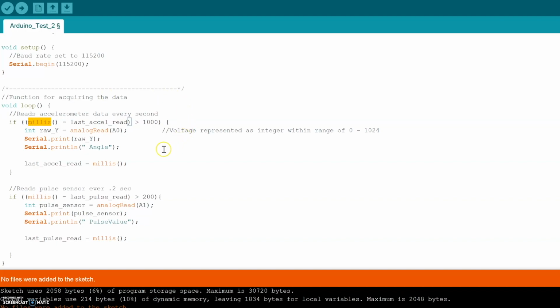After the appropriate delay is met, an integer value from the pin is read and printed to the serial port, along with text explaining which data type it is. This is how we're able to organize the data into two arrays once in MATLAB.